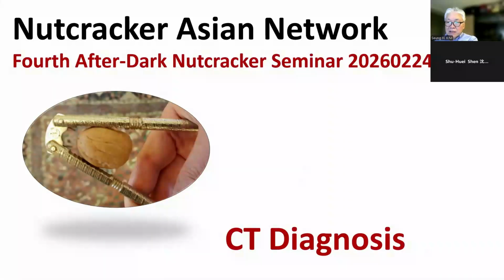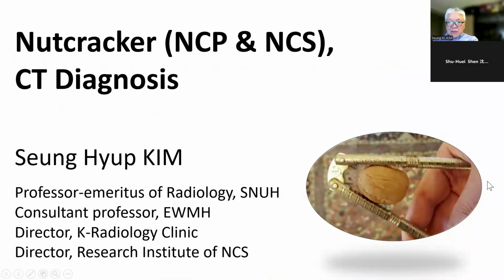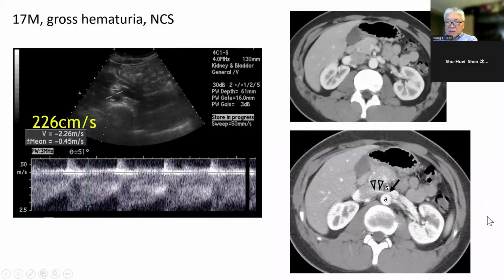And today we'll talk about the CT diagnosis of Nutcracker. Probably, I believe many abdominal radiologists see cases of the Nutcracker through CT, and probably abdominal radiologists who do Doppler ultrasound for this is not quite common.